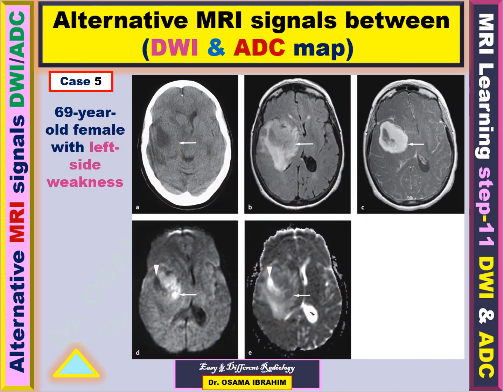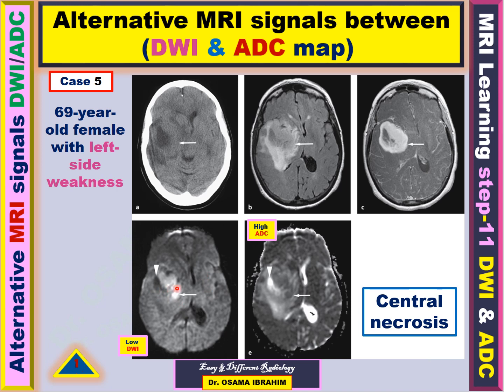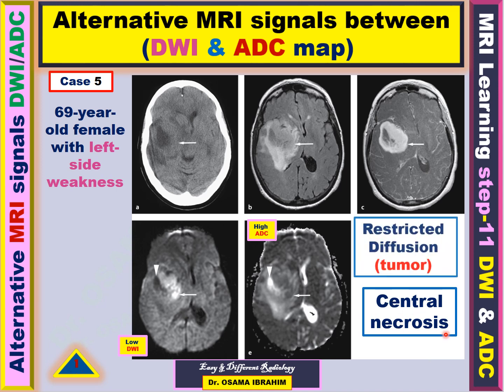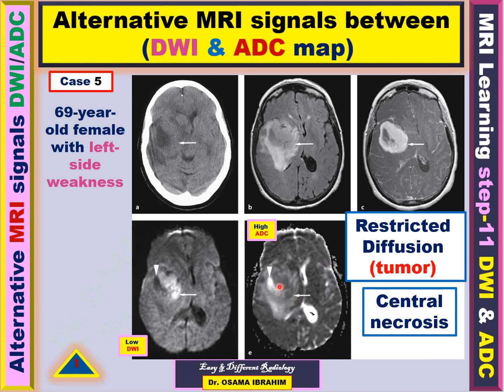The last case is a 69-year-old female with left-side weakness. We should detect the diffusion-weighted image and ADC and their signals. This area marked with an arrowhead appeared as low signal in the diffusion-weighted image and high signal in the ADC map — this is considered central necrosis. The signal in diffusion is similar to CSF in the ventricle and the signal in ADC is also similar to CSF, so it is considered fluid within the lesion mass, representing central necrosis.